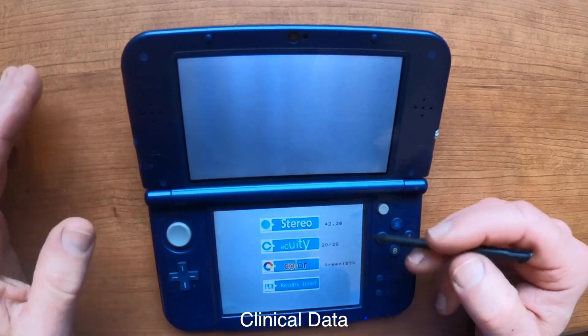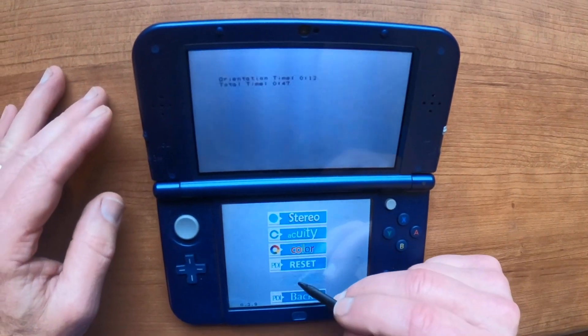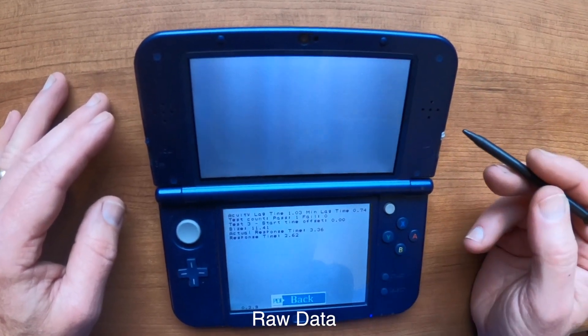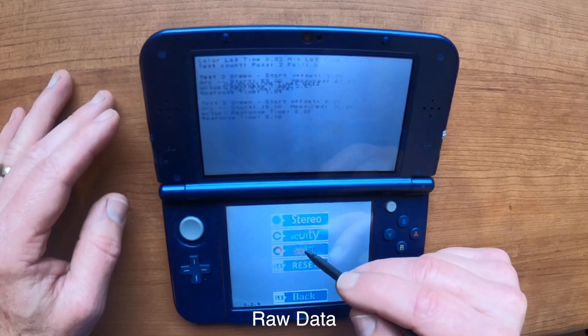This is your clinical score. The raw score gives you stereo, visual acuity, and color.